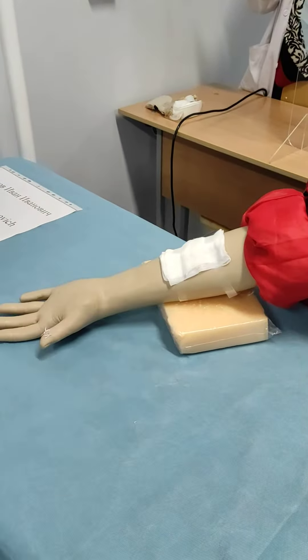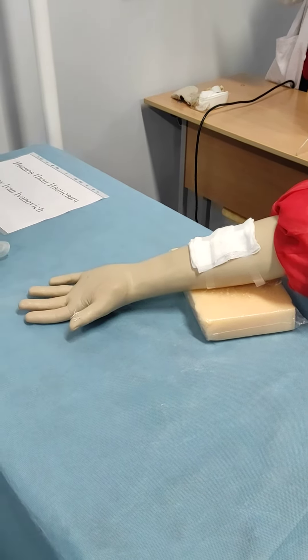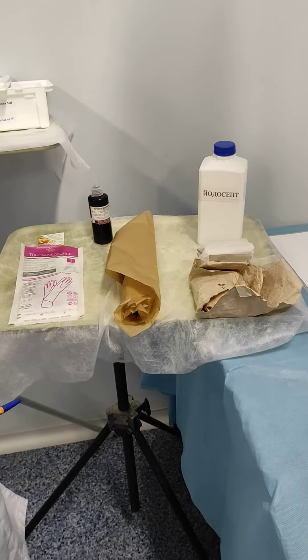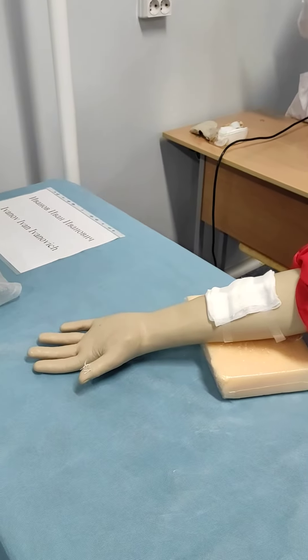In here will be a wound on his hand. As you remember, we train like this before. Peroxide will be used to... remove the second and first layer.